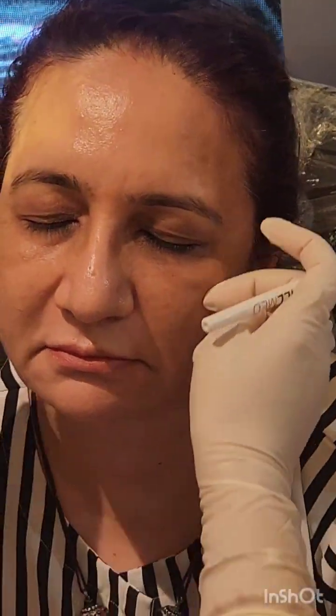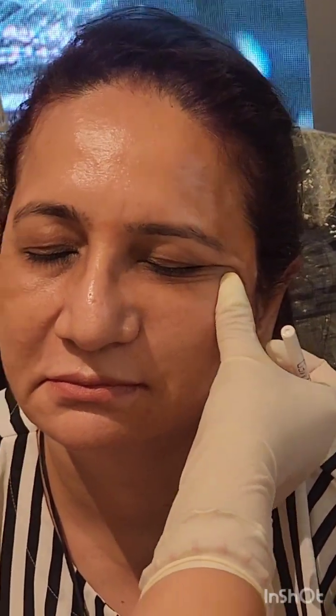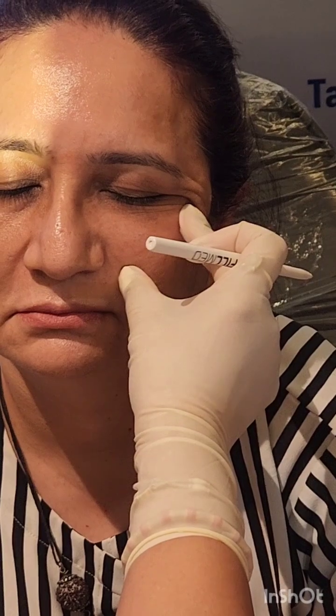So this is the line and we have 10 centimeter of the needle, okay? If I lift her face from here, she is getting 100% lifted. Can you see? Everybody come in the front, please. Otherwise, you'll miss something. This is a very important part which I want to show you all. See, if I come from here and if I lift, it's 100% lifted. But then you will be able to introduce only 3 to 4 centimeter of your thread.